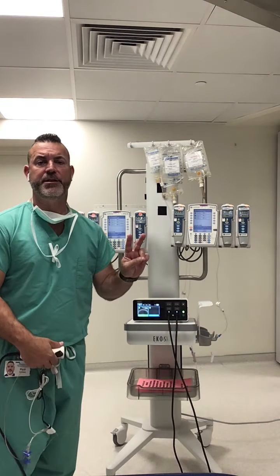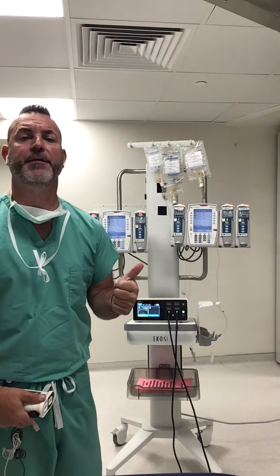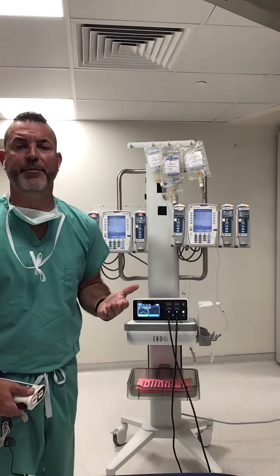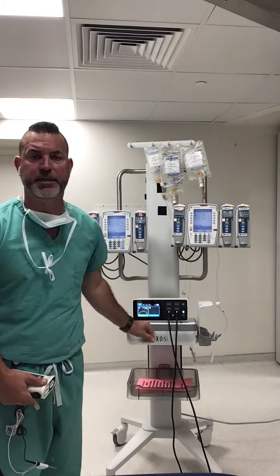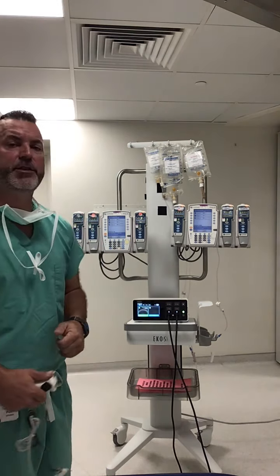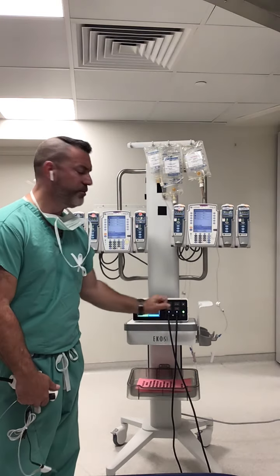Stop is for 2 reasons. There are 2 reasons why we will stop ultrasound therapy, particularly number 1, if you have a PE patient and you need to do an echocardiogram at bedside. If you do not stop our ultrasound, you will see artifact on the Echotech's screen, so you want to make sure that you stop the ultrasound by pressing the red stop button.